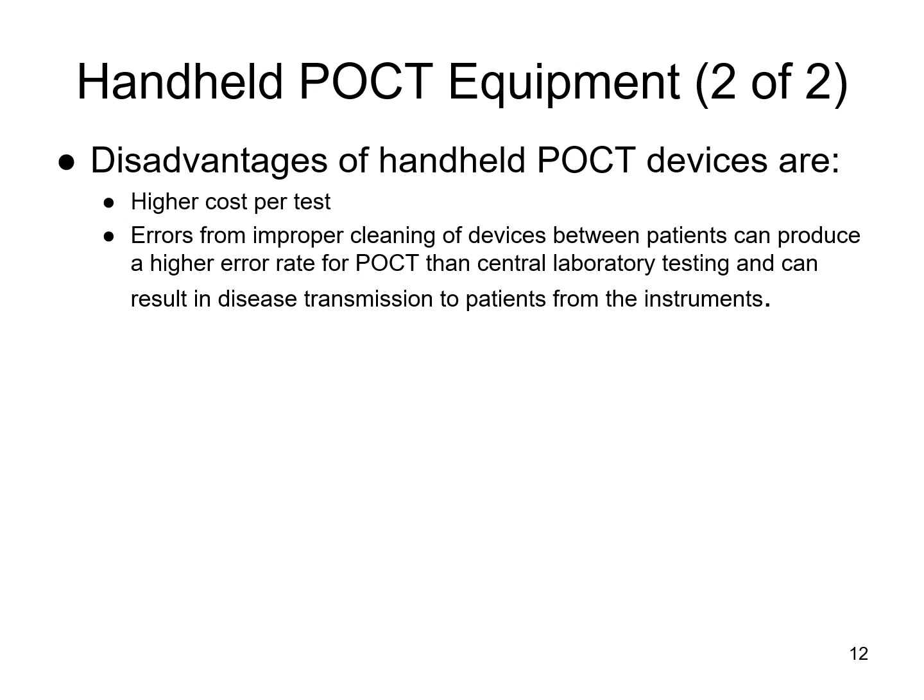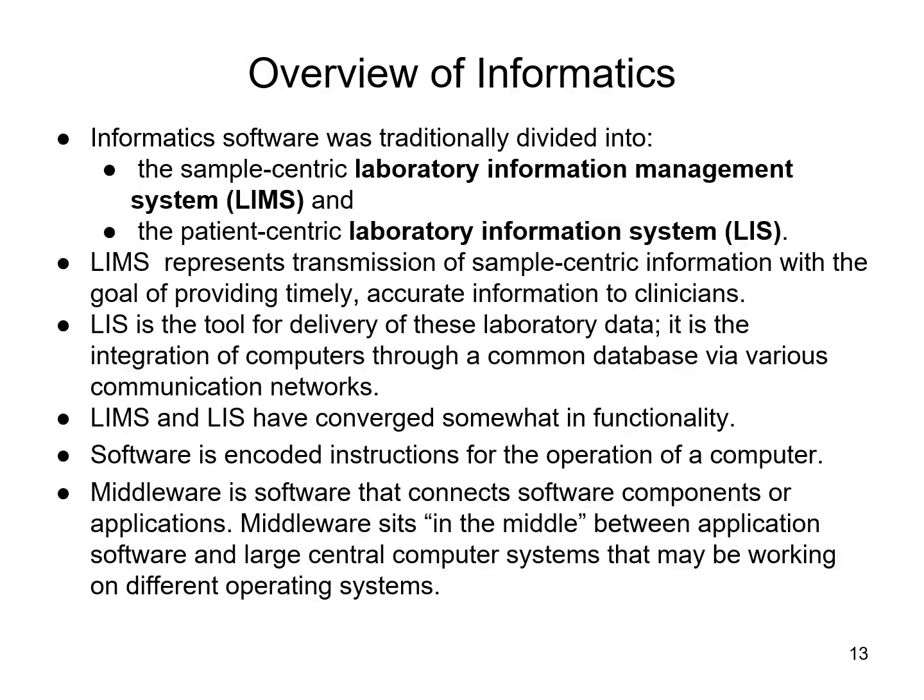If you think about the fact that a glucose test monitor, if you got blood on that machine and you accidentally touched that blood to your patient after you've pricked their finger, then you could introduce someone else's blood to that patient. Reusing test strips could introduce blood from another patient to the second patient. So you want to be very aware that you can cross-contaminate things, so you want to keep your machine properly maintained.